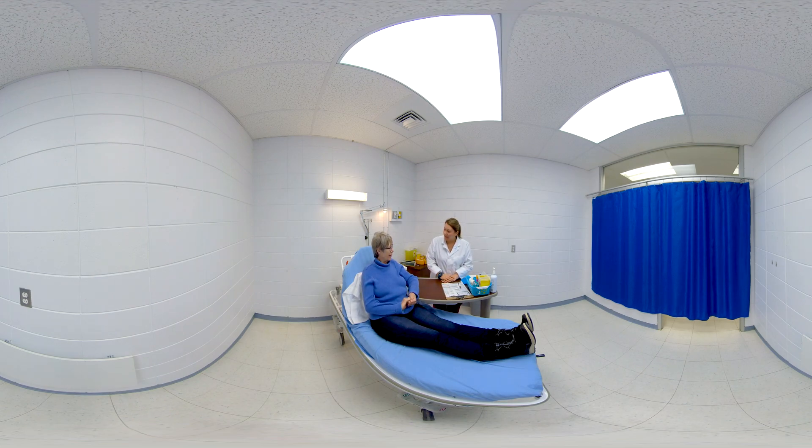Good morning, Mrs. Blacksmith. Hi, my name is Cynthia, I'm the lab tech. Could I have your full name and your date of birth? My name is Audrey Blacksmith and I was born August 9th, 1953. Perfect. And do you have any allergies? No, not that I know of. I don't remember any. I don't think so.